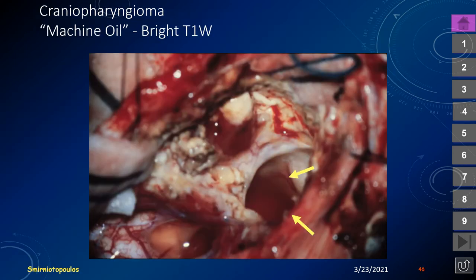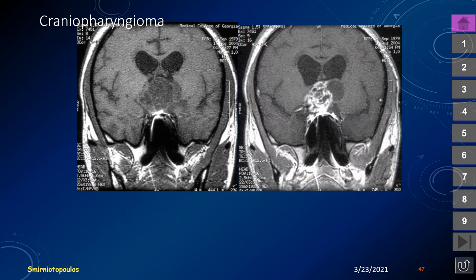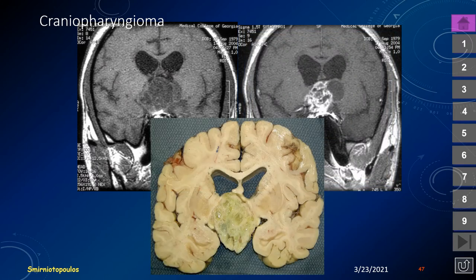The machine oil appearance is visible in operative photographs as a brownish-red discoloration, which corresponds to lipid signal intensity on MR. Another example shows a very large and heterogeneous suprasellar lesion extending into the pituitary fossa — unfortunately a patient who died from a craniopharyngioma.